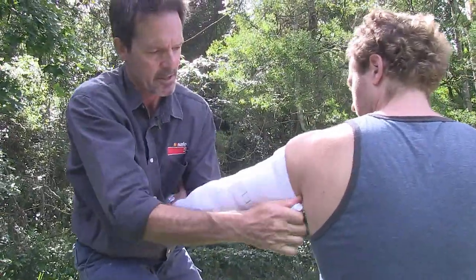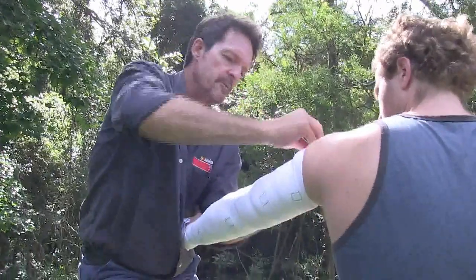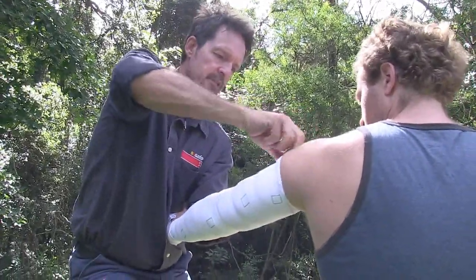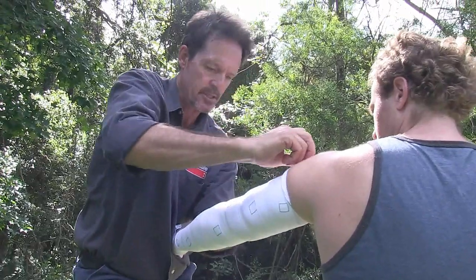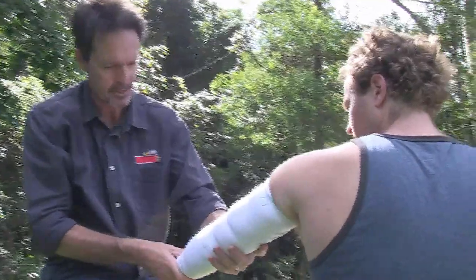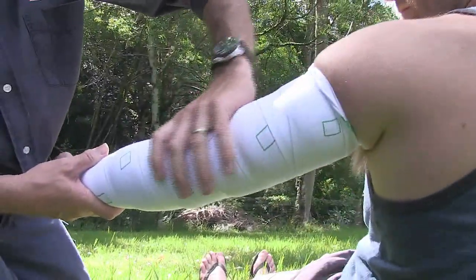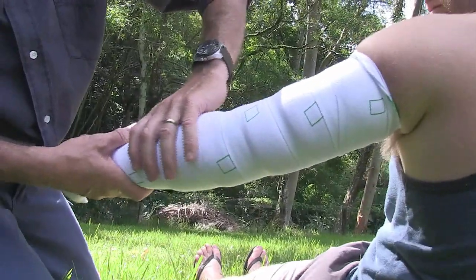It's so superior to most bandages on the market that you'd be mad not to have one of these in your kit. You can see that I've made pretty decent squares — nice geometric shapes all along your arm — and that's telling me that I've got firm, broad pressure.